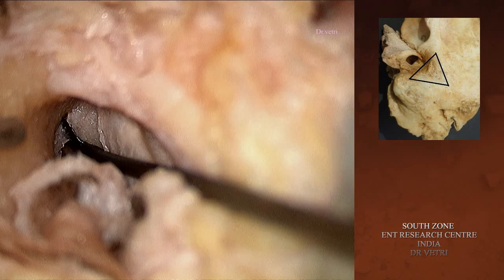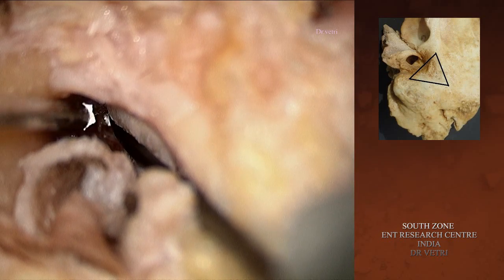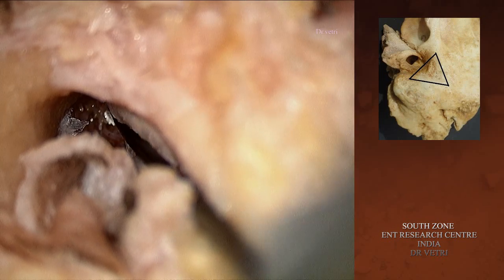Now the inferior-most part of the canal wall skin along with the annulus is being elevated beautifully.